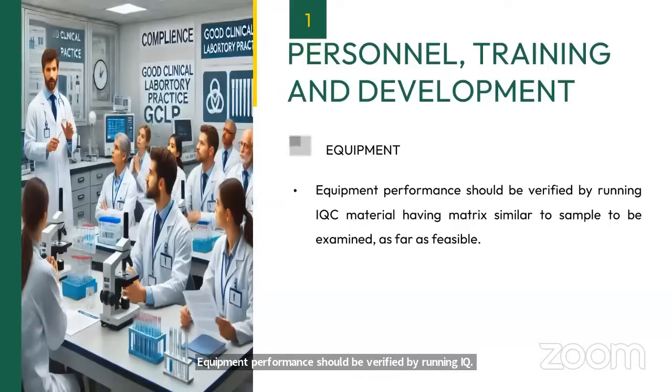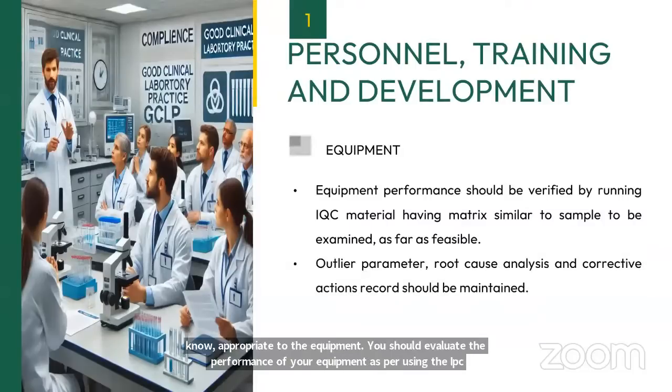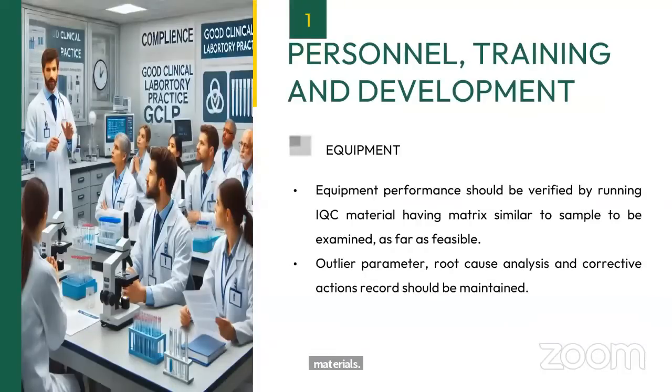So you should always use appropriate IQC material which is similar to the patient sample so that it will react in an appropriate manner to the equipment. You should evaluate the performance of your equipment using the IQC materials. Outlier parameters, root cause analysis, and corrective action should be recorded and maintained. Now we have a separate session for IQC analysis and corrective action, so we'll take it in more detail there.